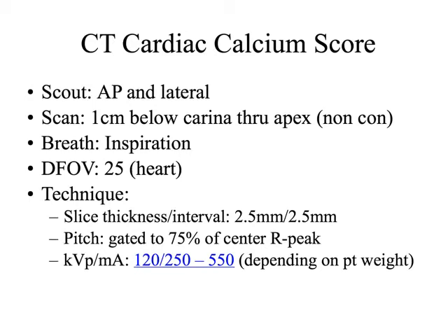And the purpose of this is to assess for risk of CAD in an asymptomatic patient, or a patient maybe with one or more risk factors for CAD, or to evaluate a patient with equivocal symptoms of CAD, or even to follow up drug therapy for patients who have had CAD in the past.